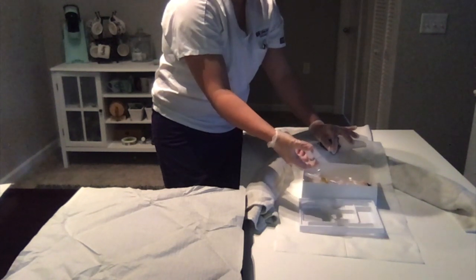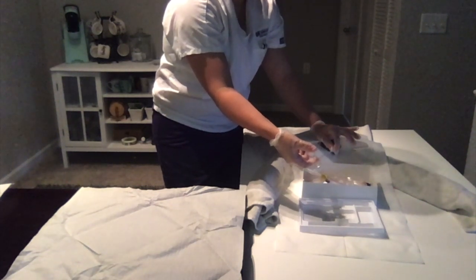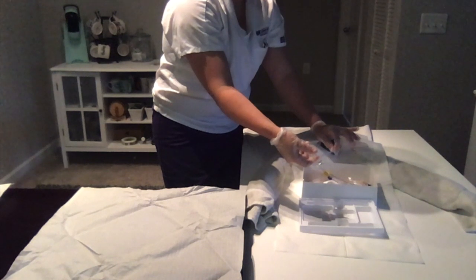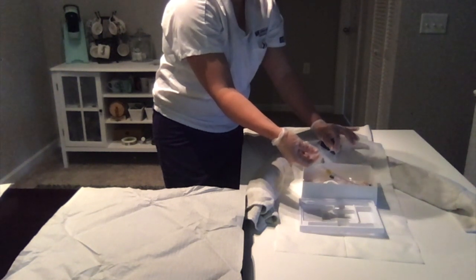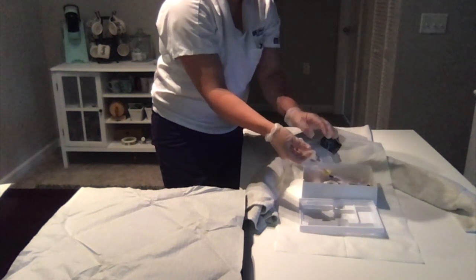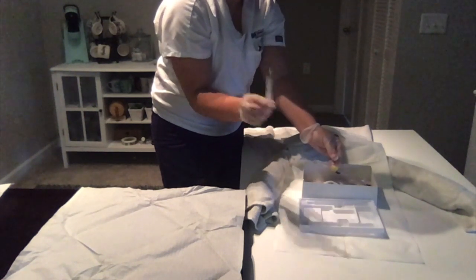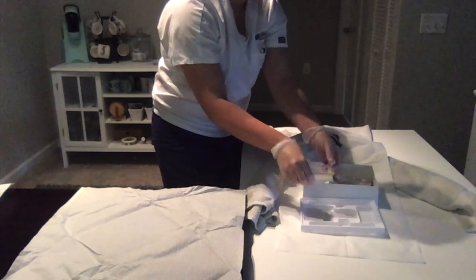And then I'm going to slowly inject the balloon and say, okay, you let me know if you feel any pressure or pain or anything like that when I insert, as I'm blowing up the balloon. So once I have put in all my cc's, I'm going to slowly pull out, and I'm getting resistance, so that's good. And I'm going to take off this part while still maintaining pressure on the plunger.